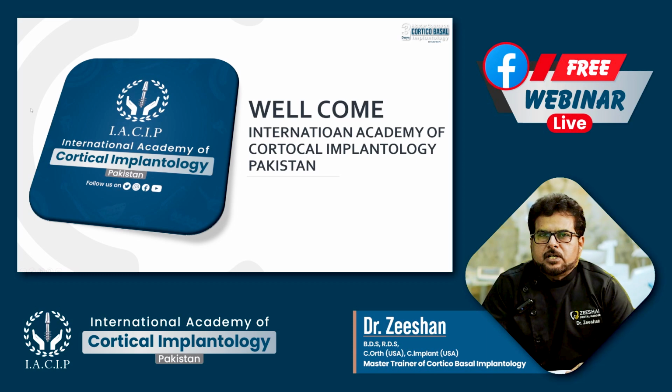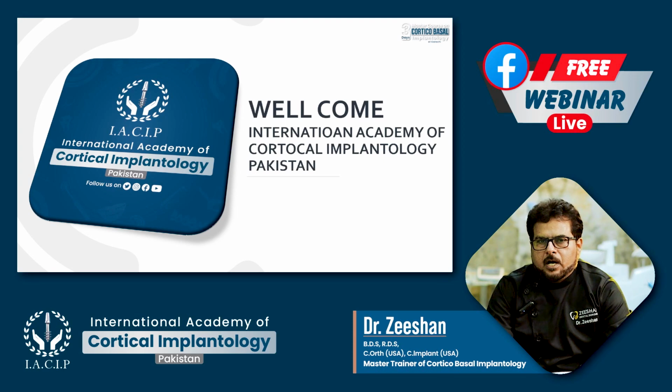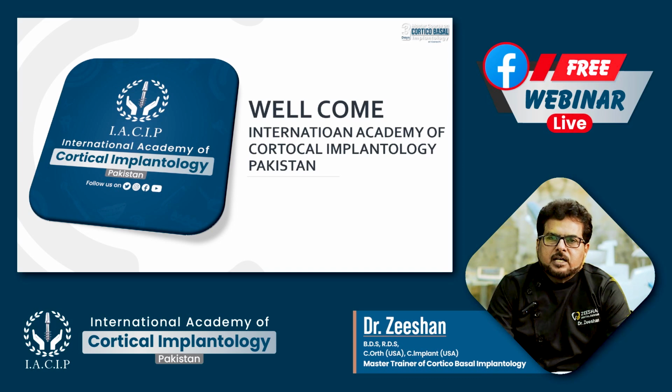With this type of implant, as I have told you, we have to reach the basal bone or the deeper areas in the bone. So we have to learn the technique, how to reach the second cortex, and first of all we have to identify the second cortex, the cortical or basal bone, where it lies and which bone we are going to engage.